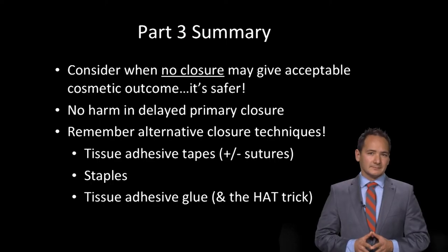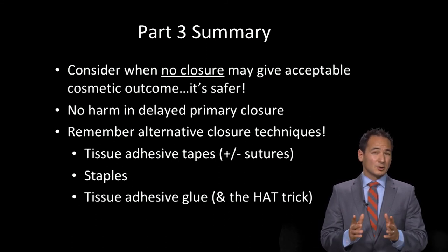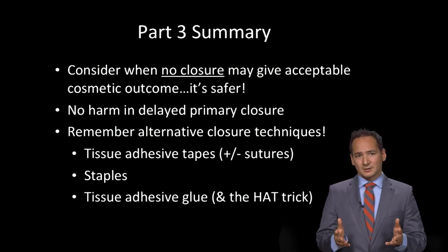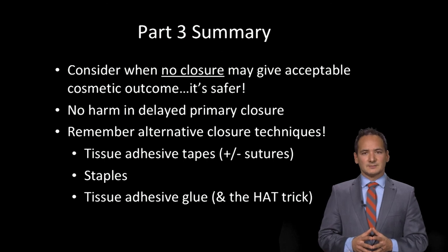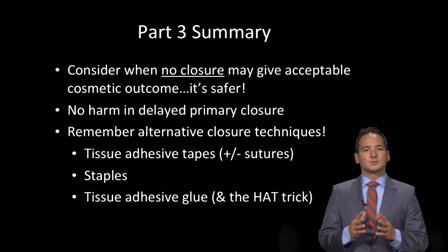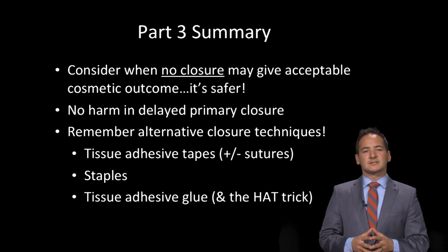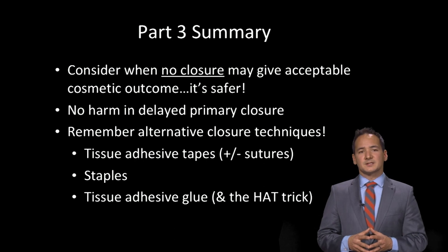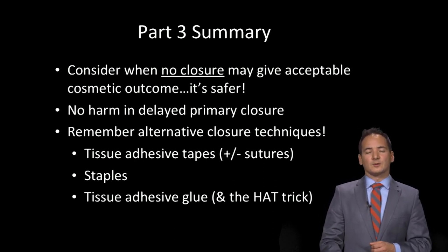So that's part 3. Just remember, in summary, consider times when no closure may give you an acceptable cosmetic outcome. After all, it's a safer way to go. Also, there's no harm in using a delayed primary closure technique in most situations. You also want to remember alternative closure techniques, like the use of tissue adhesive tapes, plus or minus sutures, the use of staples, and the use of tissue adhesive glue, and the hat trick. And that concludes part 3 of our wound care lecture.